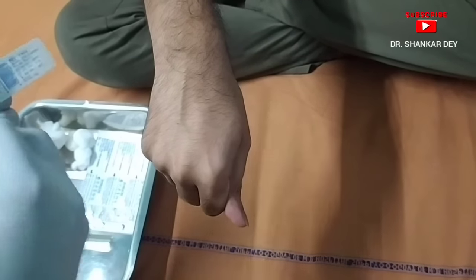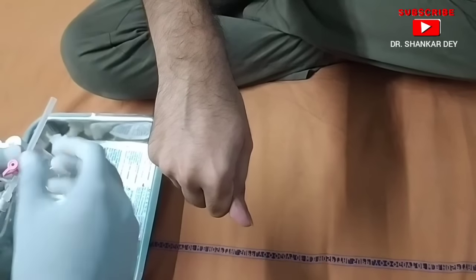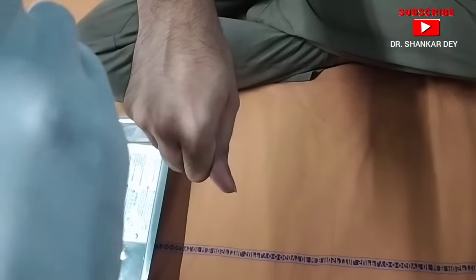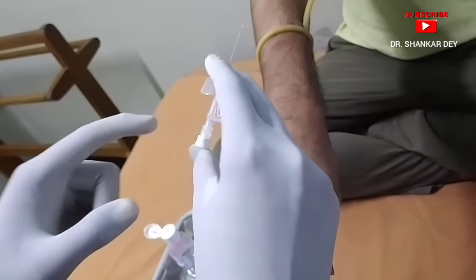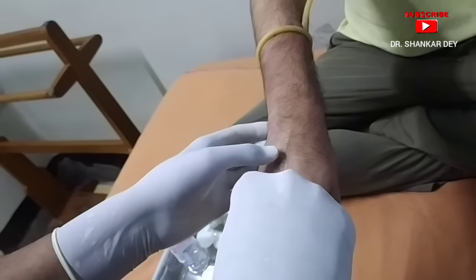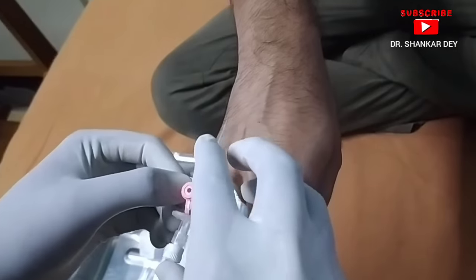Now open the cannula from the sterile pack and hold the cannula with the two wings together, with the bevel end of the needle pointing upwards. I am opening the cannula and holding it with my three fingers — two on the wings and one on the distal end.